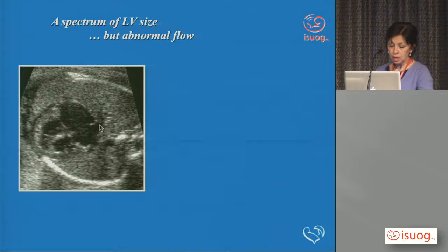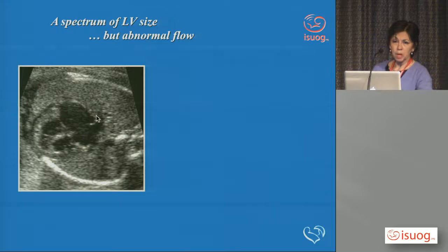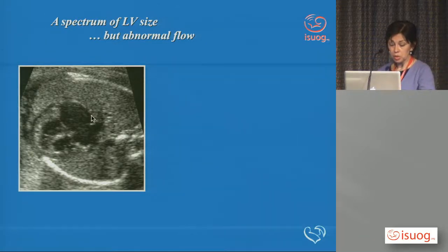This is again another case. It's without color, and it's a magnified image. Look back, stop, make sure that you see valves. We do have two valves here, but in real time, that valve opens and that valve hardly opens.